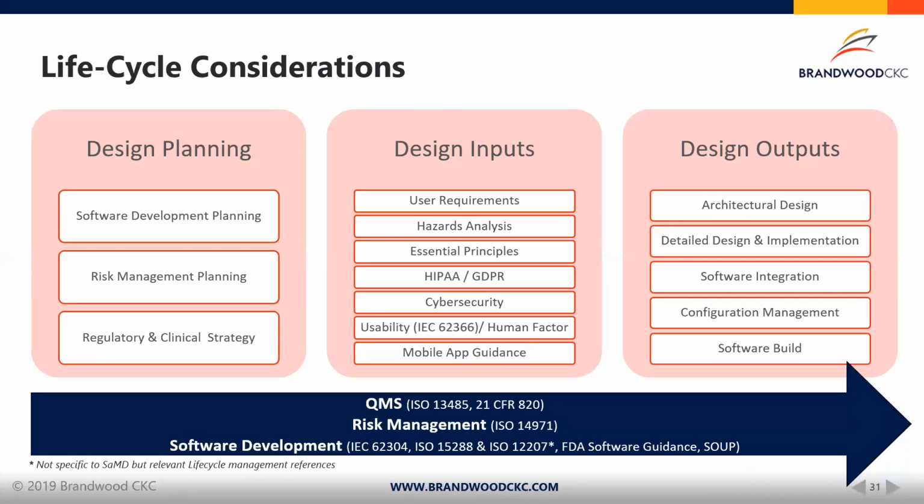We thought we'd briefly look at some key QMS lifecycle considerations. The next 2 slides will look at the typical design and development process as described in ISO 13485 and the FDA's 21 CFR 820. Foundational are the overarching quality management system standard, risk management, and software development standards that I mentioned before. Though we have presented this sequentially, there are iterative software processes within some of the design implementation stages that should be factored in, and overall we're showing a high level here.